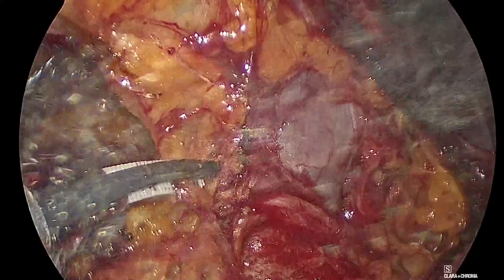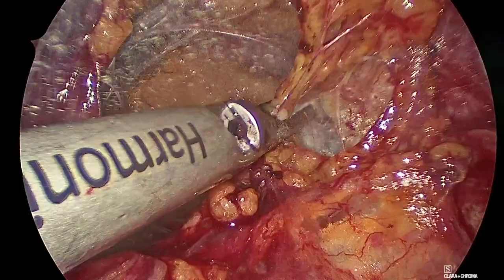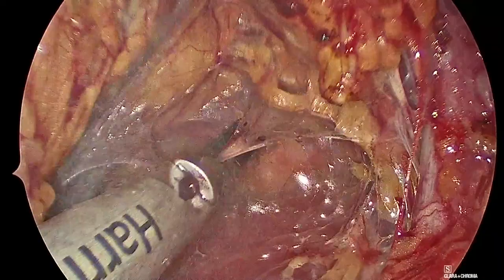And also there was no real need to mobilize the colon, right? I'm sorry? There was no real need for you to mobilize the colon to get to where you want to be. Well, I mobilized the colon a little bit, but not too much because you don't need to mobilize it very much. Now, this is a nephroureterectomy, so we will need to take the ureter all the way down to the bladder and generate a bladder cuff.